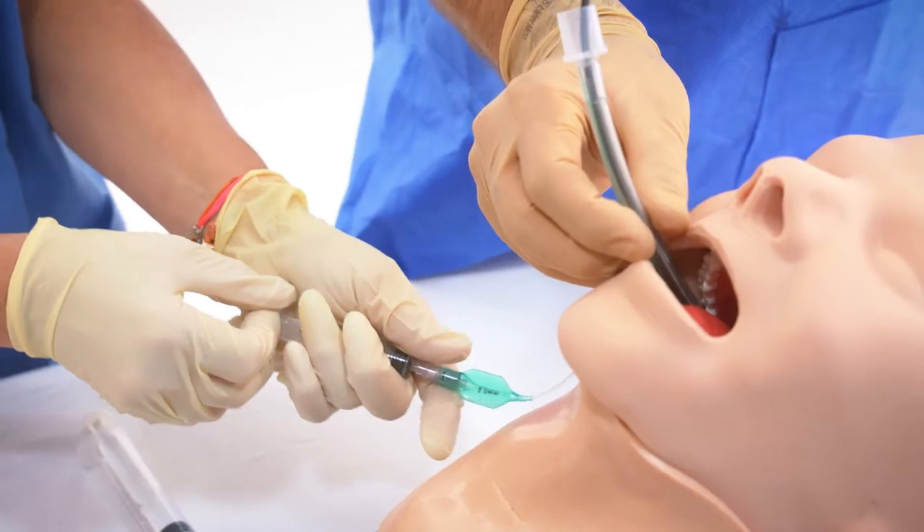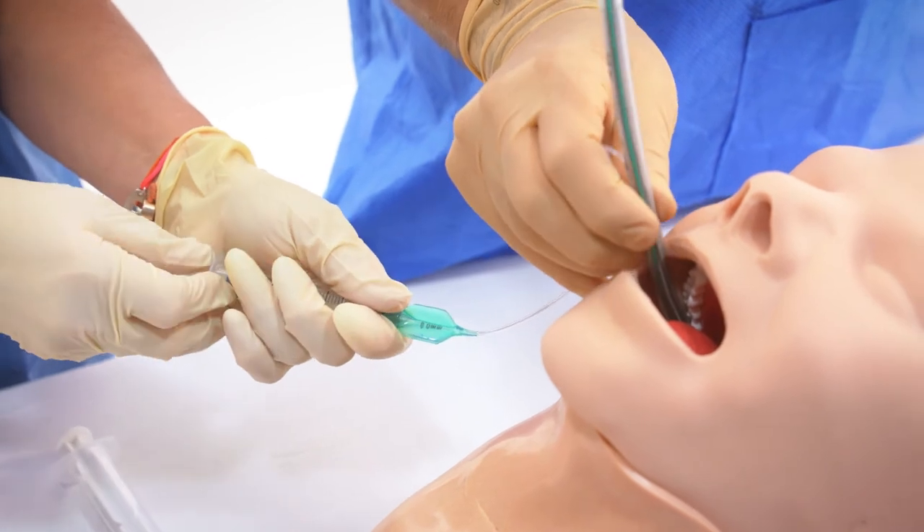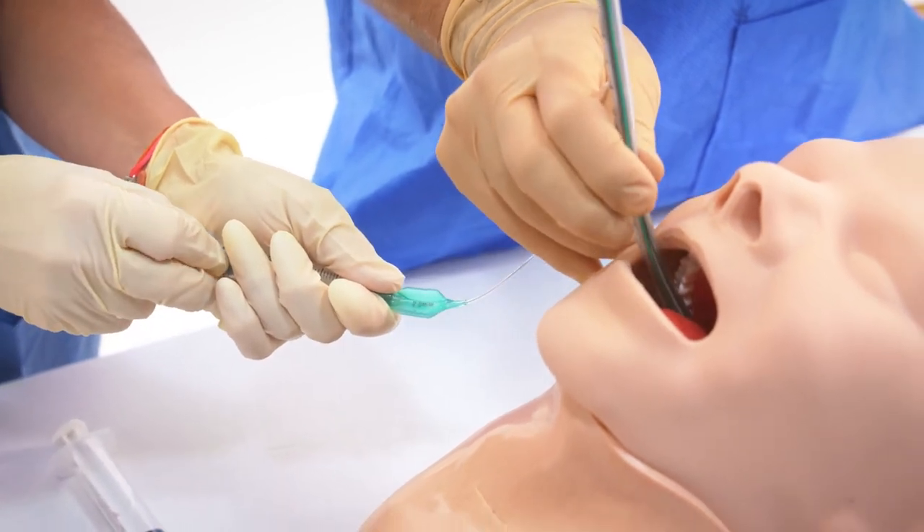The endotracheal tube cuff is deflated, placed above the insertion site but within the trachea, and reinflated.